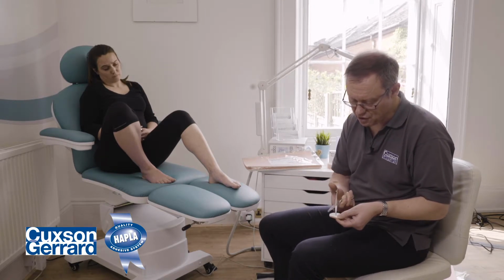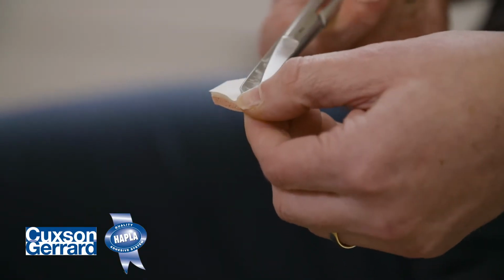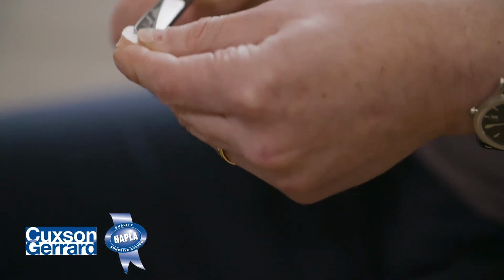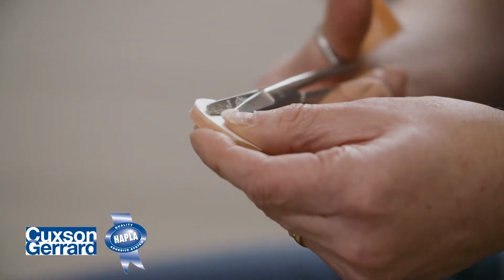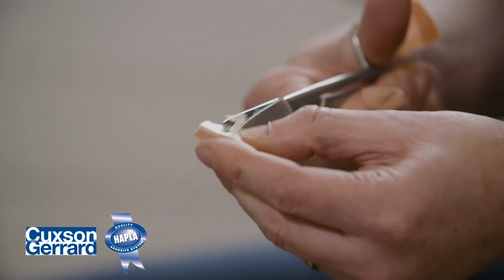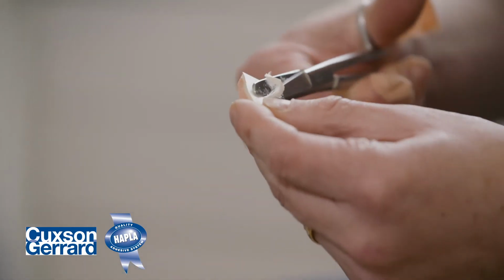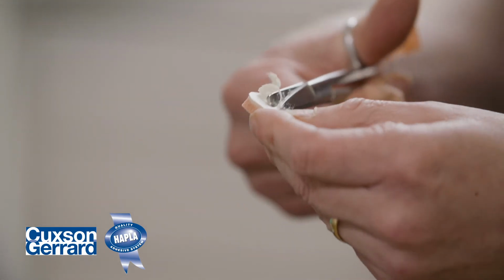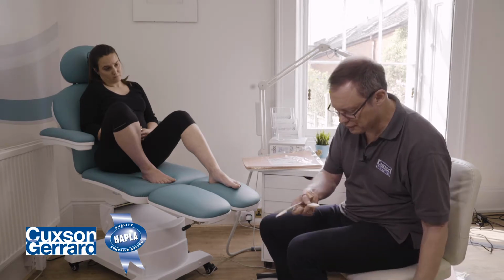So we do that again by inserting this point of the scissor parallel to the paper, just underneath the felt, and making our hole a larger diameter. So around we go. We want this aperture to be larger than the lesion site. We want that because we want to make sure the shoulders of the aperture basically follow the upward contour of the lesion site, which often is apparent in these kind of lesions. Okay, so that hole will probably be large enough now.